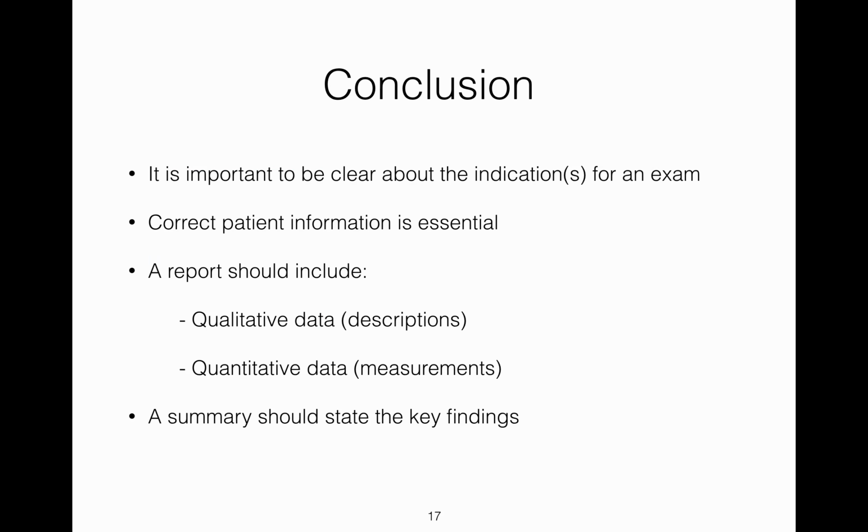In conclusion, it's important to be clear about the indications for an exam. Correct patient information is essential. A report should include qualitative information and quantitative data, and a summary should state the key findings from the study.